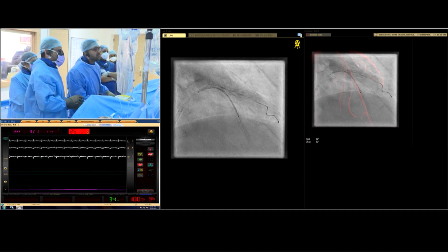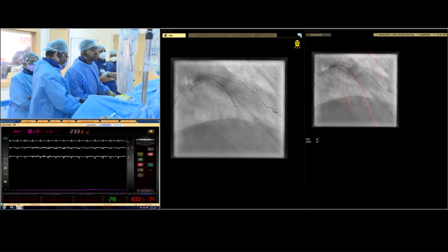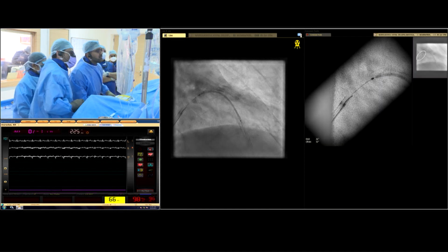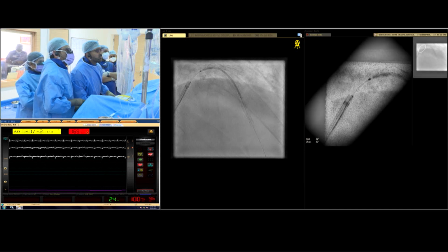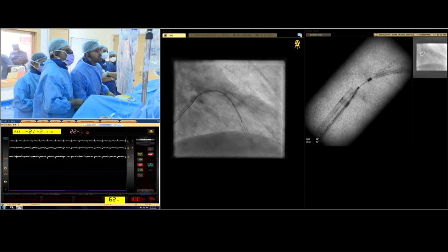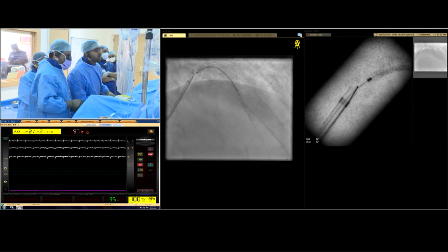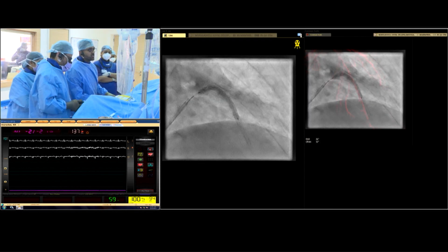One second. Okay, we're just going to take the circ wire off. I just want to be prepared. Abu. Yes, sir. Ready, sir? Go up, Abu. Yes, sir. Quick. Yes, 2, 3, 4. Nice. Okay. 10, 12, 12 nominal, 14, 14, 16, 16.